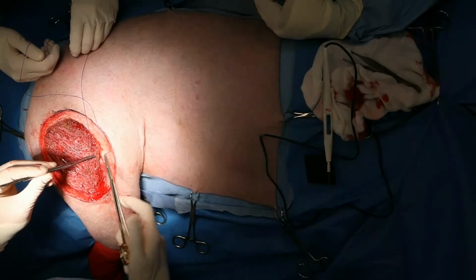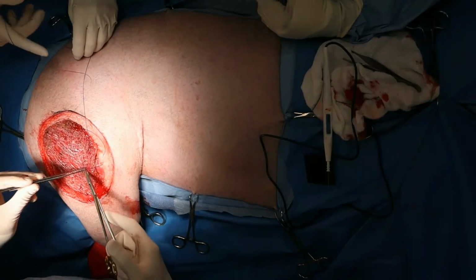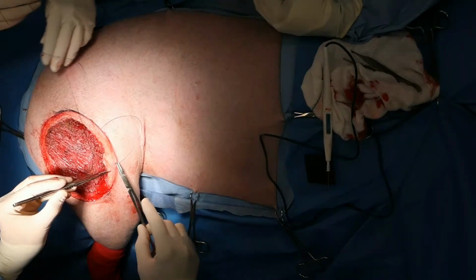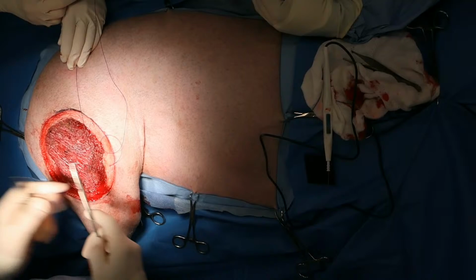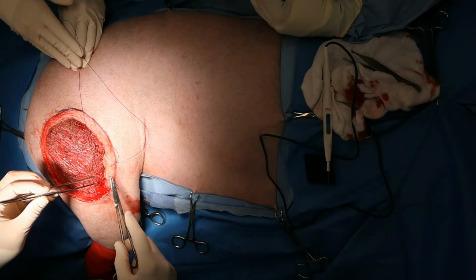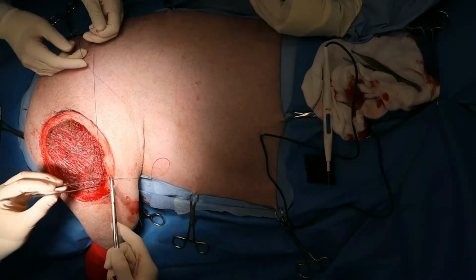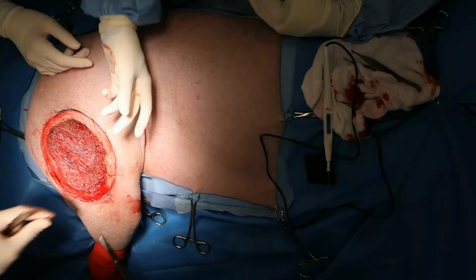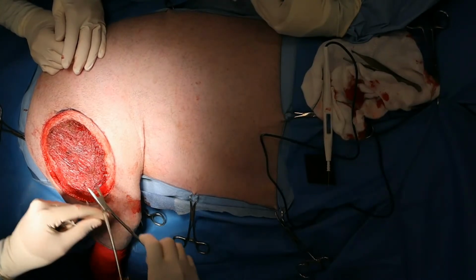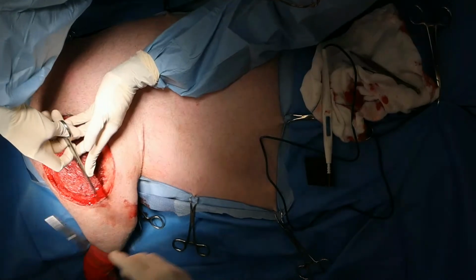Yes, so caudal superficial epigastric, and then there's one more. Actually, two more. So the deep circumflex iliac, which comes out right here at the tip of the iliac wing. You have dorsal branch and ventral branch. So that would also work. And then you could also do a caudal fillet, where you fillet out the tail, and you've got two big vessels that run down either side of the tail, so you basically amputate the tail but keep the skin, preserve those vessels, and that works really well as well. Have you done that many times? I think I've done it once. Yeah, it's reported, but I've only done it once.